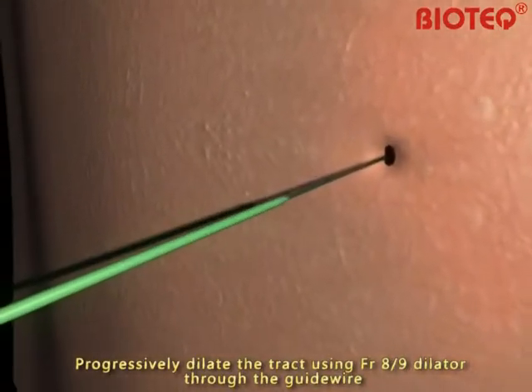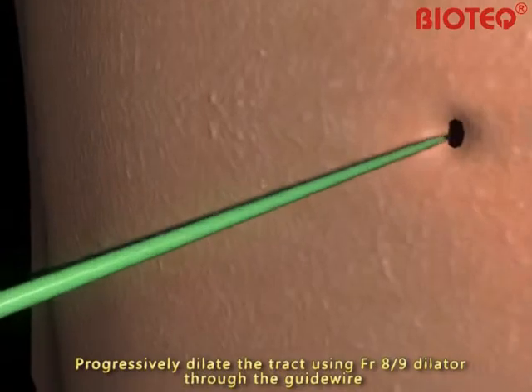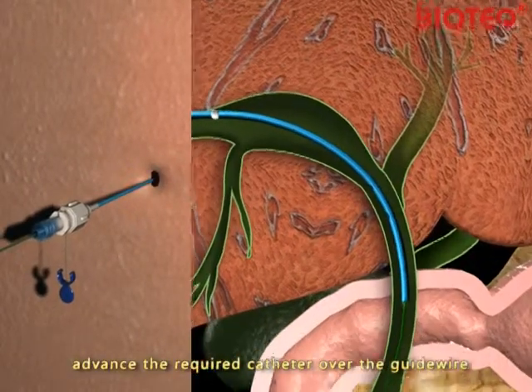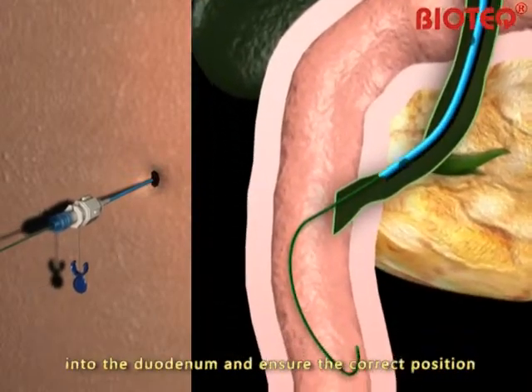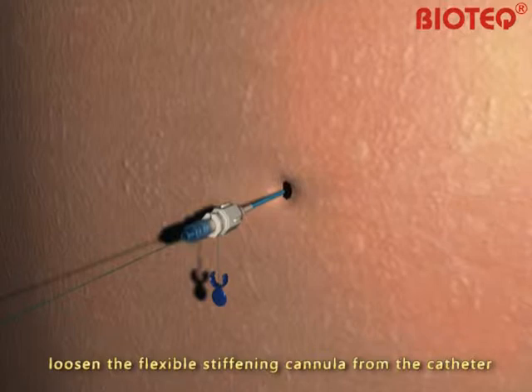Progressively dilate the tract using French gauge 8 and 9 dilators through the guide wire. Using fluoroscopy, advance the required catheter over the guide wire into the duodenum and ensure the correct position.